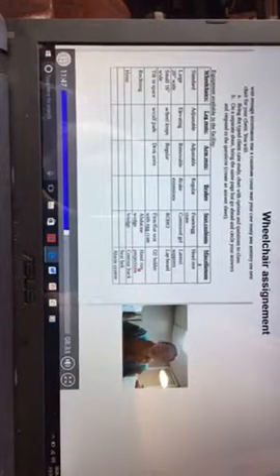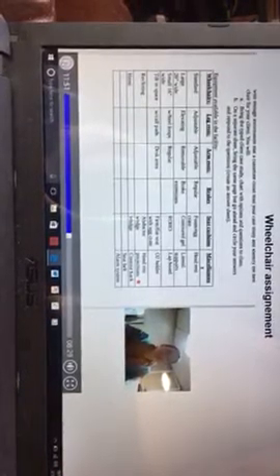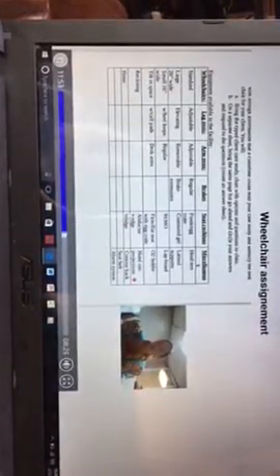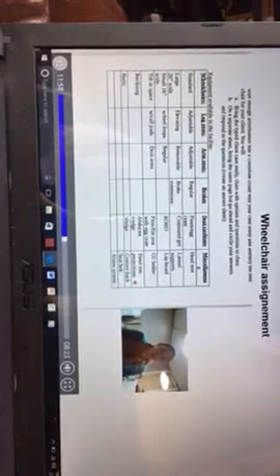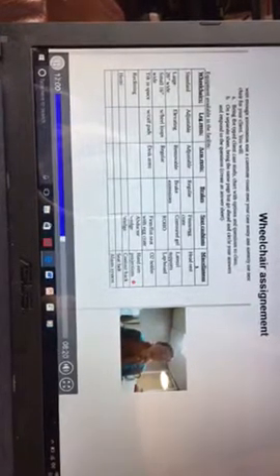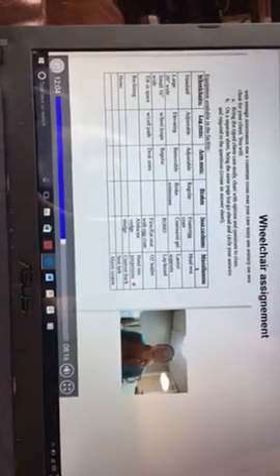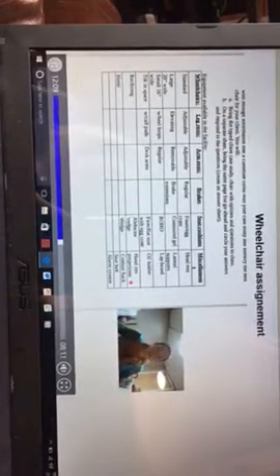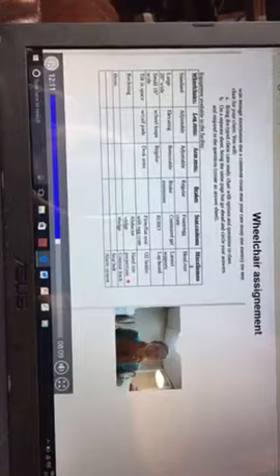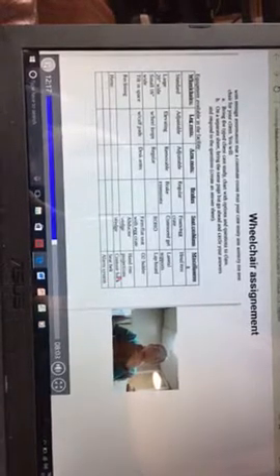An O2 holder, obviously, if they have oxygen that they need. Hand rim projections are basically little spokes that come out from the side of the wheels that help people get a better grip. I've had clients with arthritic hands, poor hand function, not a lot of good grip strength, use those because it allows you to not have to grip the rims as tightly to get good propulsion forward.